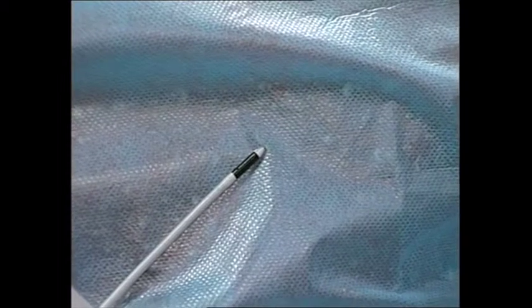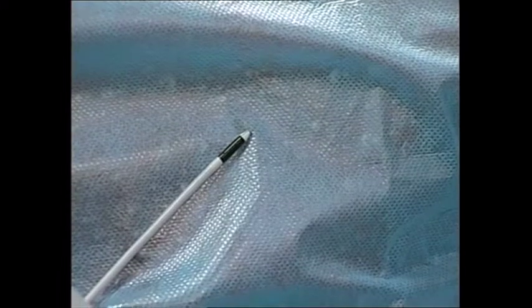The concept of cautery here is different from the cystotome. So you're familiar with, for example, Cook has a cystotome. There's an Endoflex cystotome. Those are solid ring, diathermic rings. This is not a diathermic ring. Here you're using cautery just to enable easy and smooth entry into the target cavity.